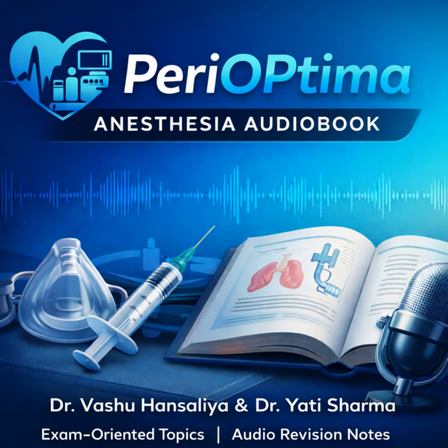If a patient is agitated, combative, altered, common in the ICU or ER, AFOI is very likely to fail. You can't get the cooperation, and you can't apply the topical anesthesia you need. What about the airway environment itself? Massive airway bleeding or secretions. This is cited as the single most common reason for FOI failure, period. Because you just can't see.